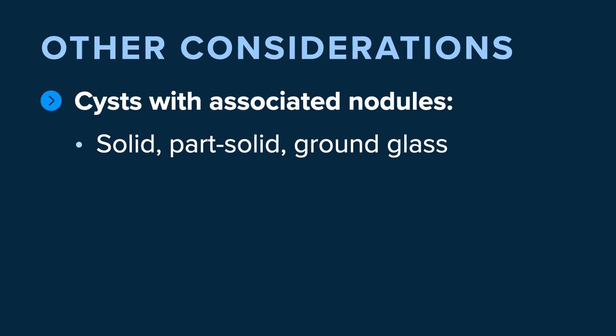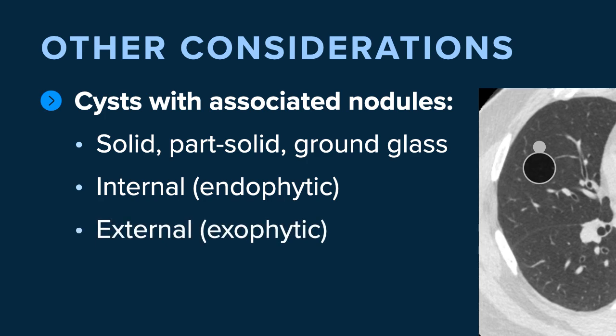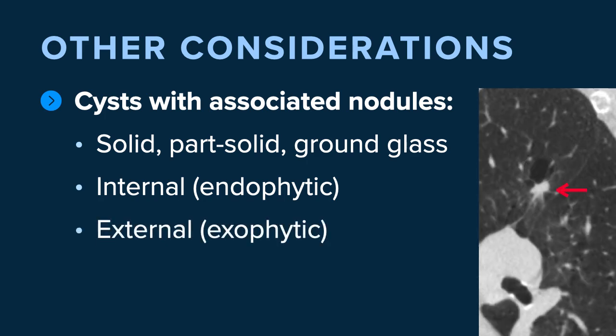There are some other considerations. Everything we've talked about so far applies to atypical cysts with wall thickening, nodularity, or multilocular cysts. But what about cysts that have nodules arising adjacent to the wall rather than directly within the wall? These nodules can be solid, part solid, or ground glass. They may be internal to the cyst — an endophytic nodule — or they could be external, an exophytic nodule. Here's an example of an exophytic nodule: we see the cystic component with a nice discrete soft tissue nodule adjacent to the cyst.